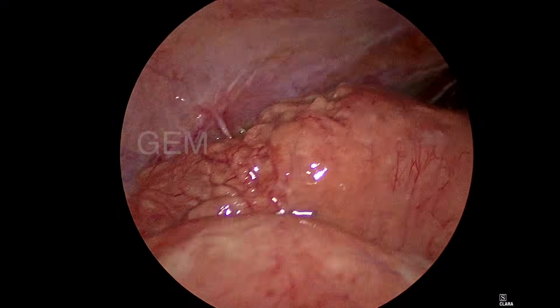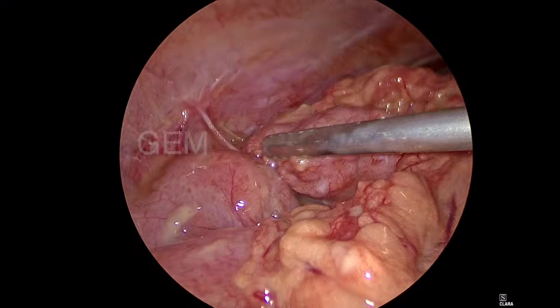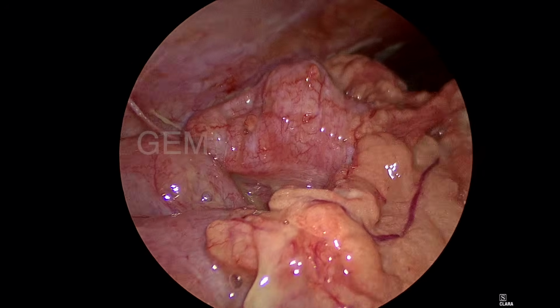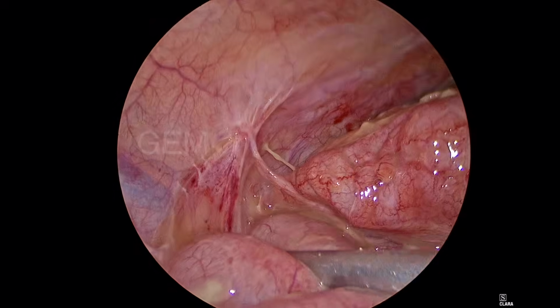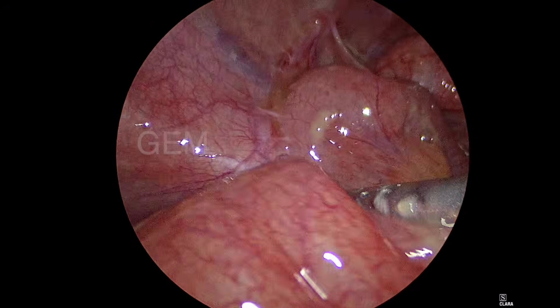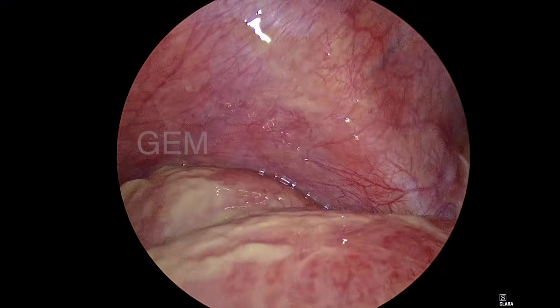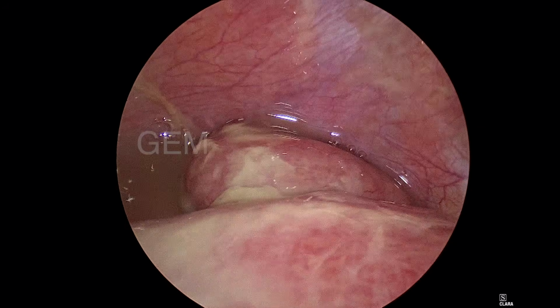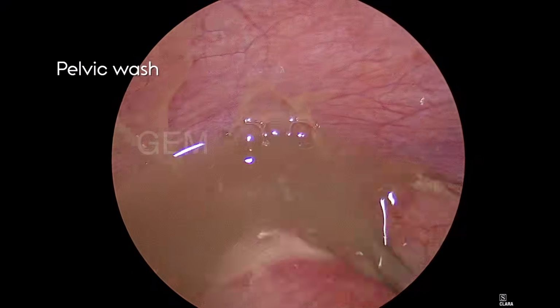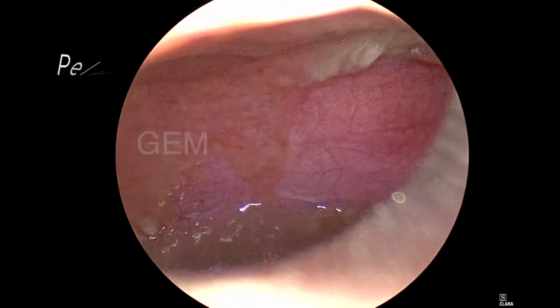First, you have to give a thorough wash before starting the procedure. So I am taking the omentum. First is the omentum. I have to take the omentum up, find out the pathology site, and place the working port, the left hand working port. This is the pelvic collection. I am clearing the collection.